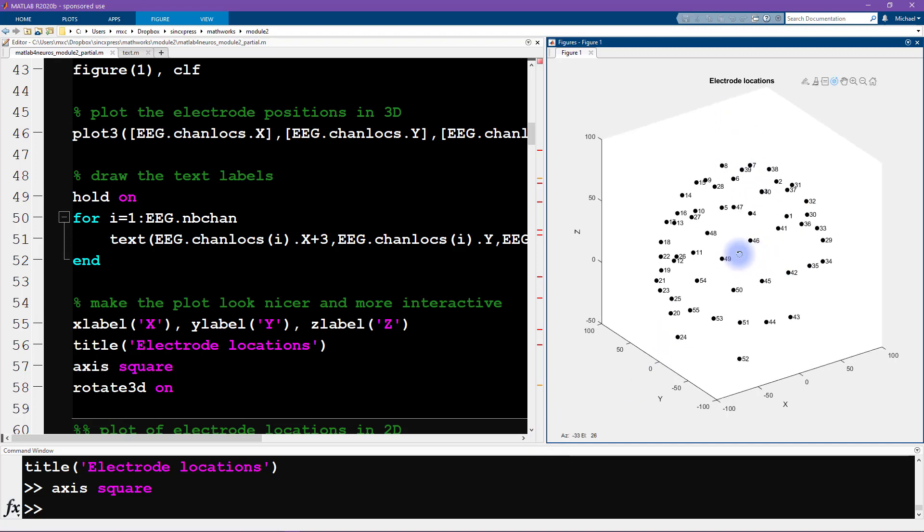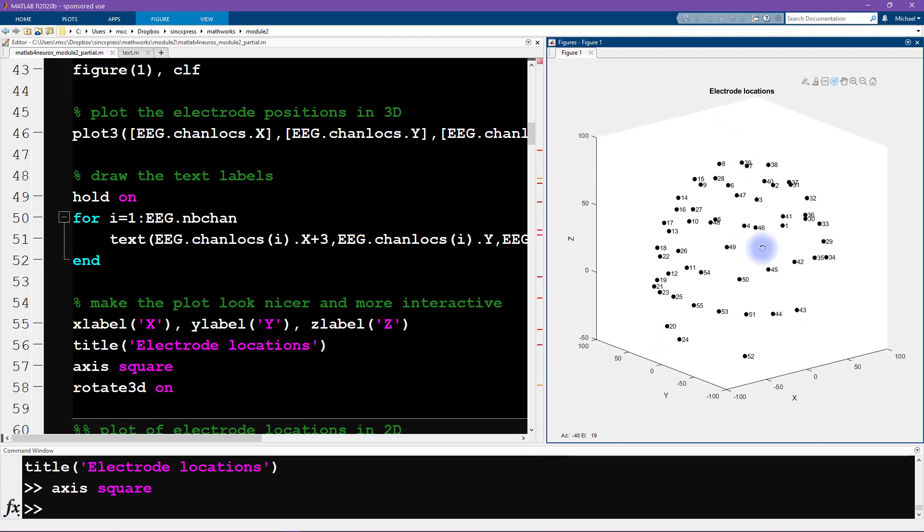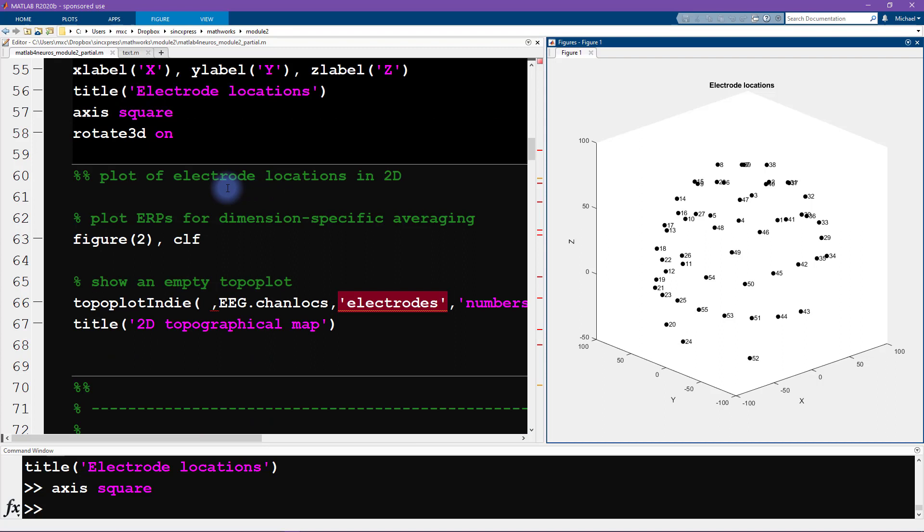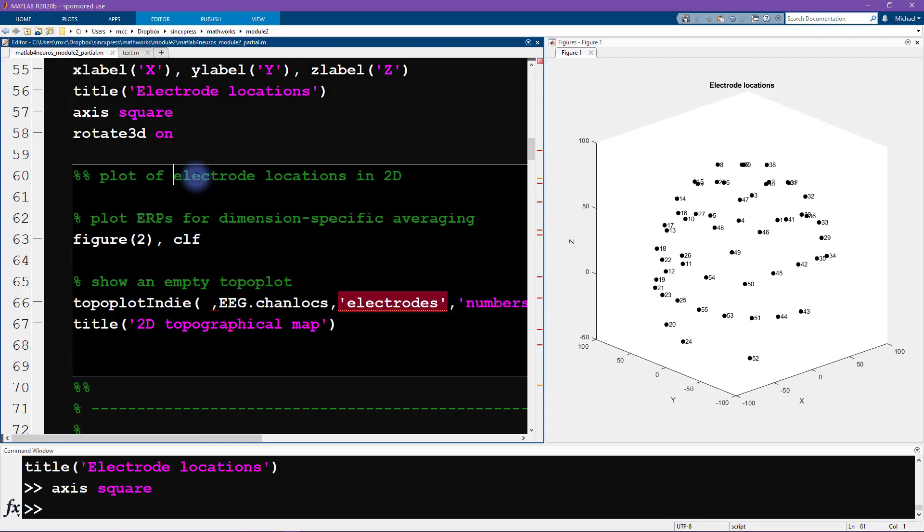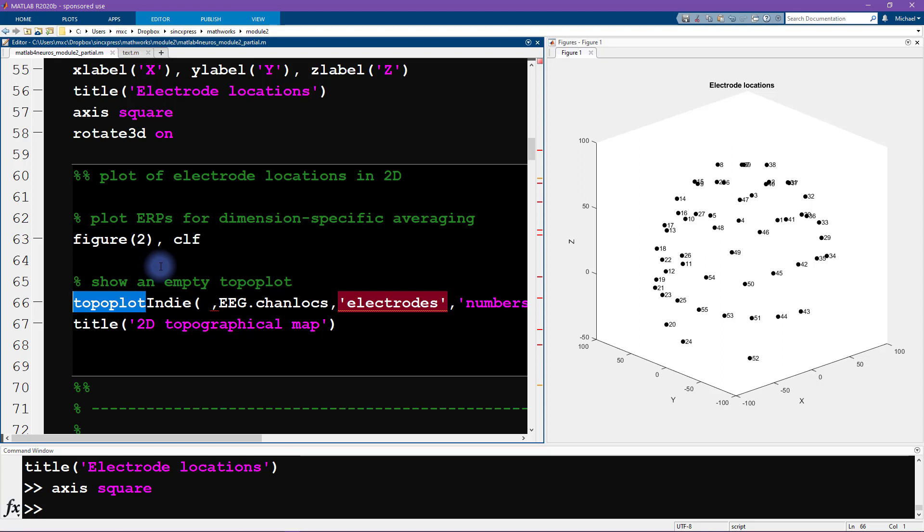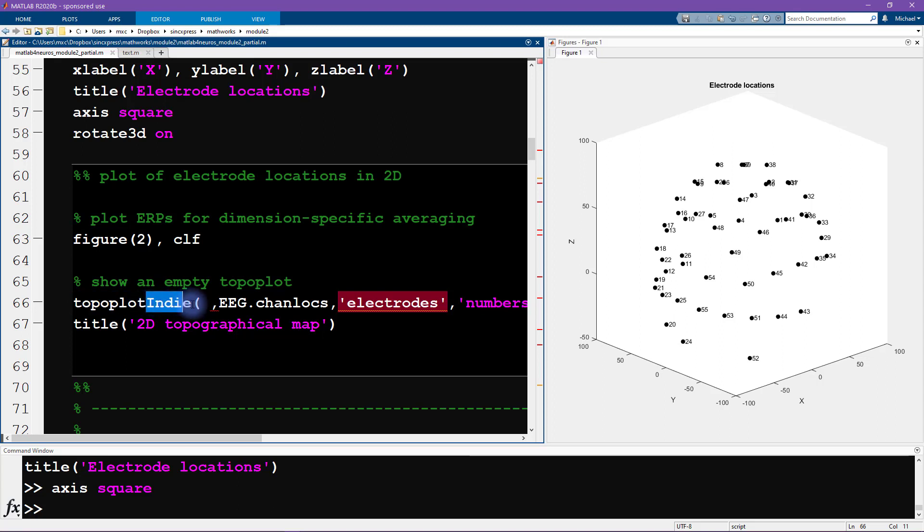So this shows our locations in 3D. And now we are going to make a plot in two dimensions. Here we're going to use a function called topoplotindie. This is a hacked version of the function topoplot that comes with the EEGLAB toolbox. I basically just modified the function slightly so that it doesn't rely on the rest of the toolbox. The only reason for that is that you can then use this function without having to install the entire toolbox.